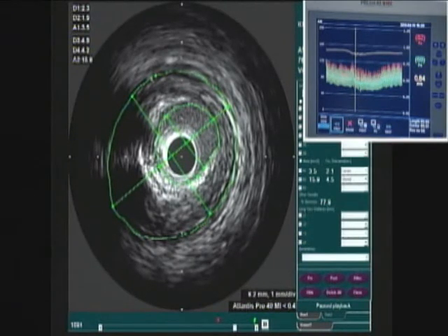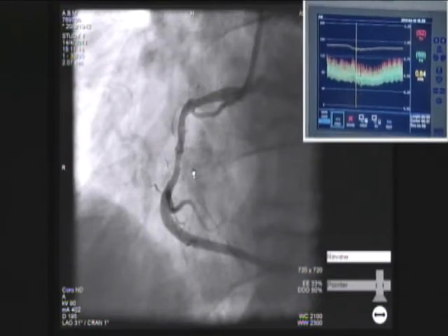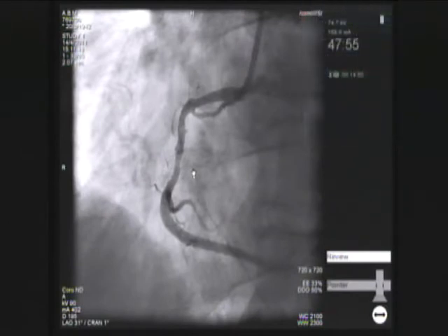Park actually reported even smaller numbers. He reported 2.5, 2.8, but you have to be careful. In his analysis, he included 1.5 vessels and 2.0 vessels, and I don't think there is a good correlation once you go to such small vessels. Maybe you don't have to do anything to such a vessel, but when you're dealing with 3.0 and 3.5, the correlation works very well. So, Alex, what did you decide? Yeah, we don't have much time left because we're going to show two interesting cases in the other labs.